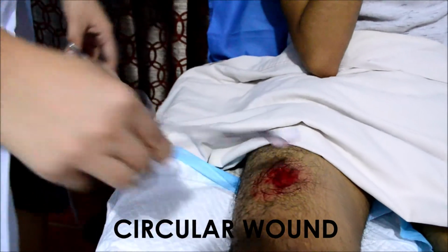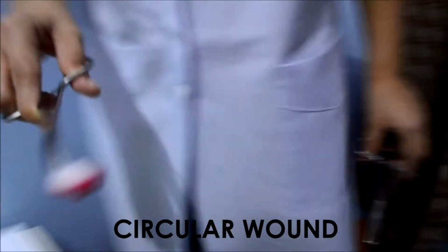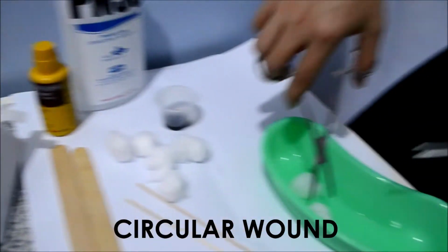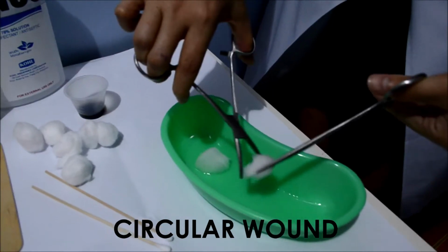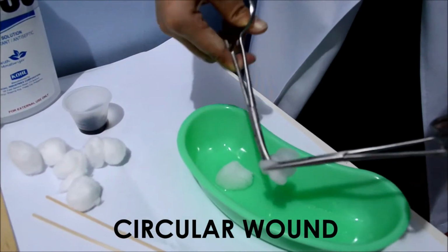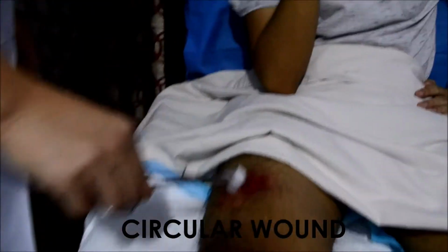Do this thrice. With your right hand, get the dressing forceps in the dressing set. If the cotton ball is too wet, squeeze out the excess solution by twisting between the dressing forceps and pick up forceps.